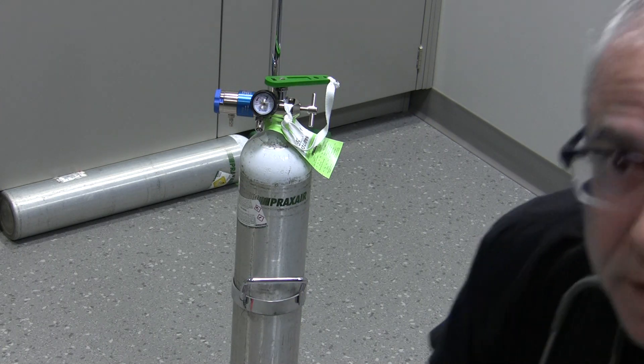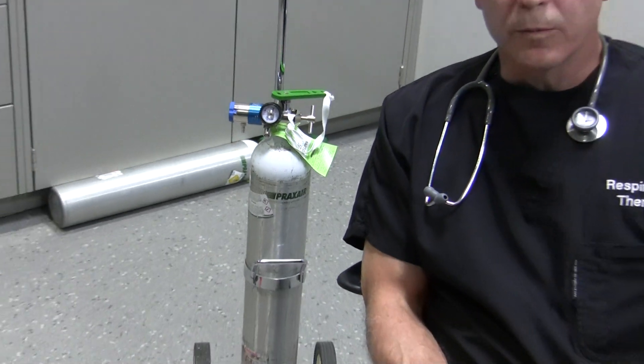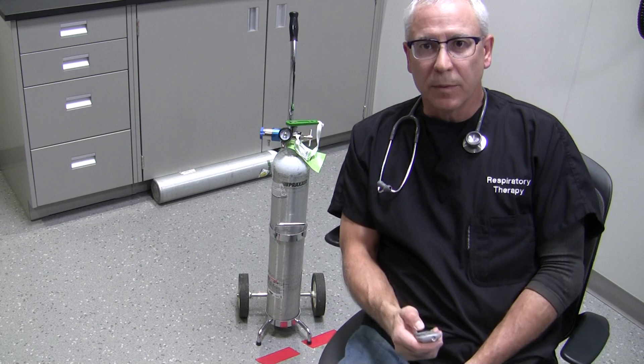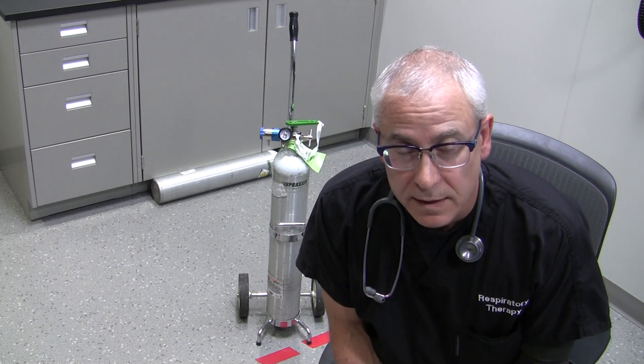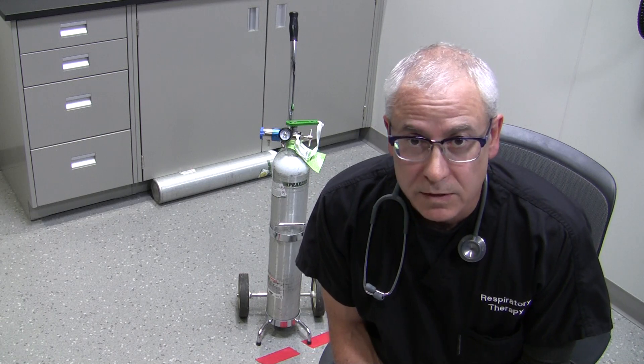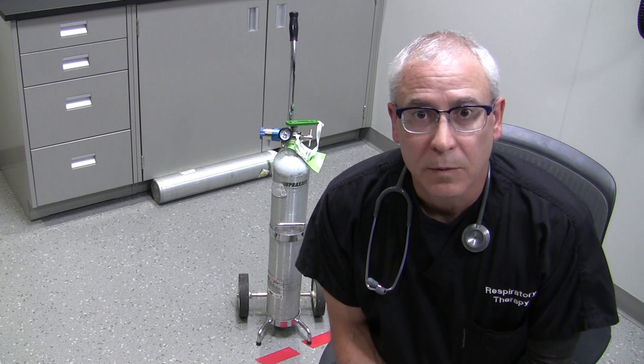Always remember safety first. When dealing with your patients, always make sure you are wearing the proper safety equipment — the proper PPE. Wash your hands before you see them, don gloves or safety glasses, and whatever else you need to wear for proper protection of yourself and proper protection of the patient.